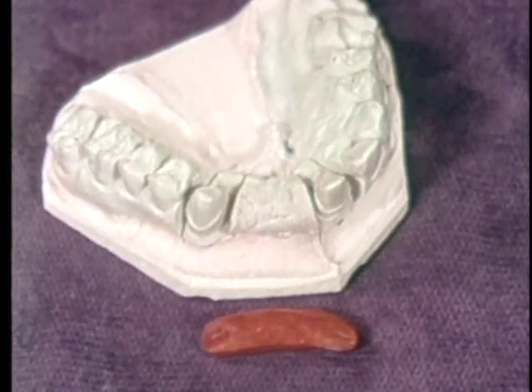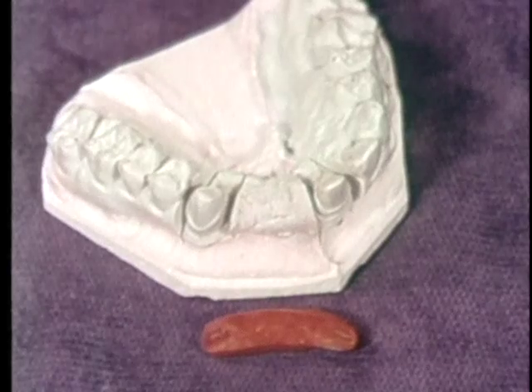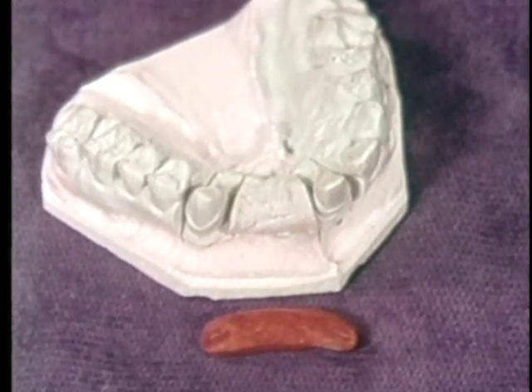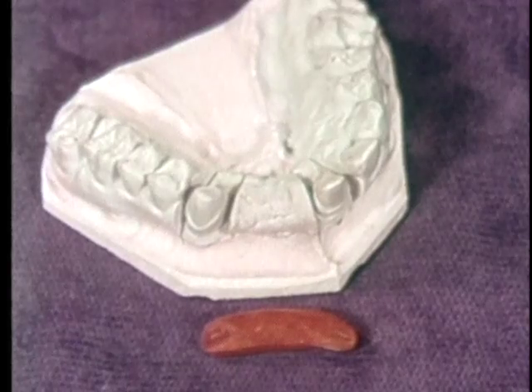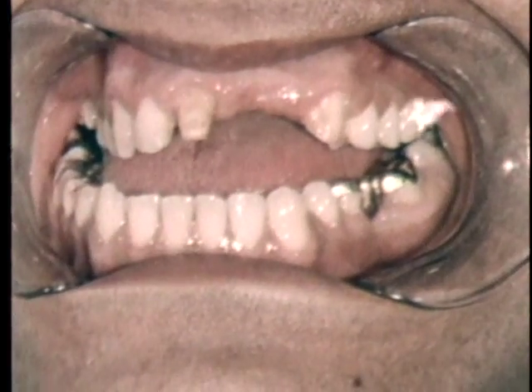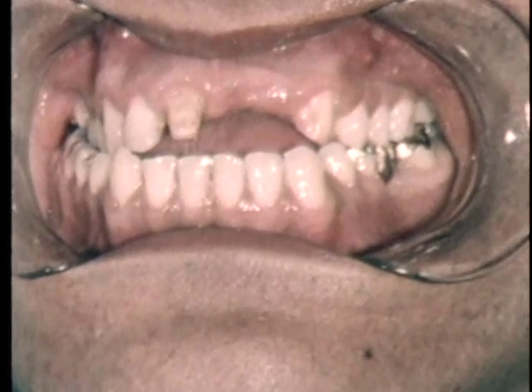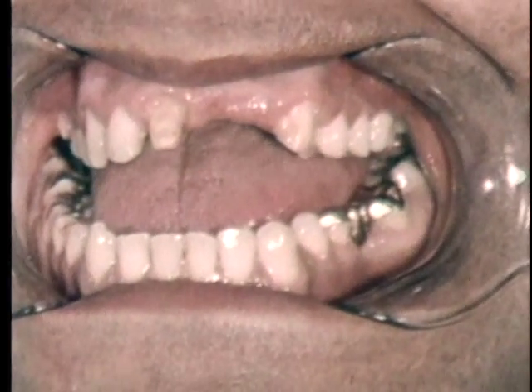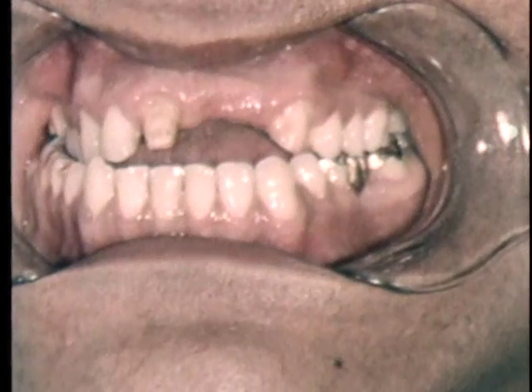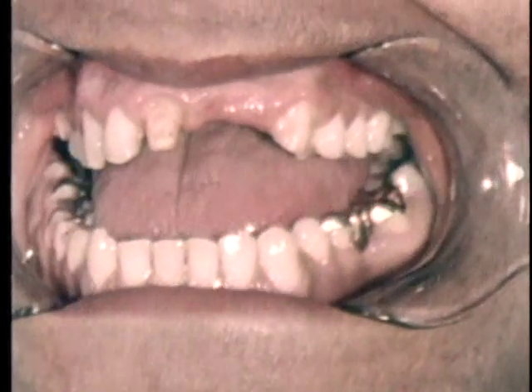If prepared anterior teeth are involved and a positive anterior stop is necessary, a trimmed incisal index made of resin is recommended. This patient has sufficient teeth remaining to normally allow for hand articulation of casts; however, his occlusion is not stable.